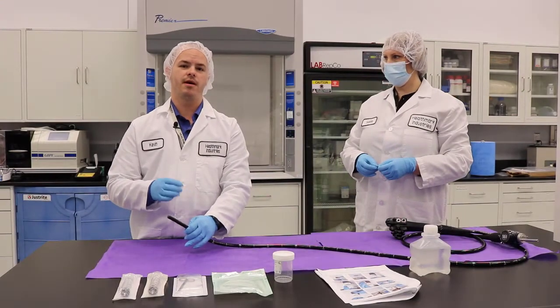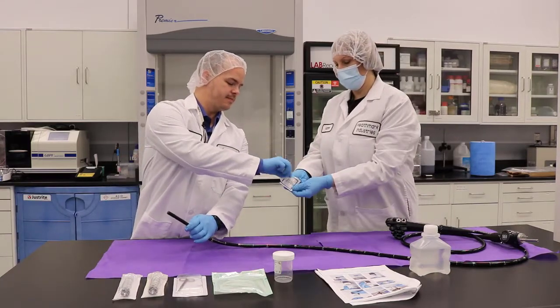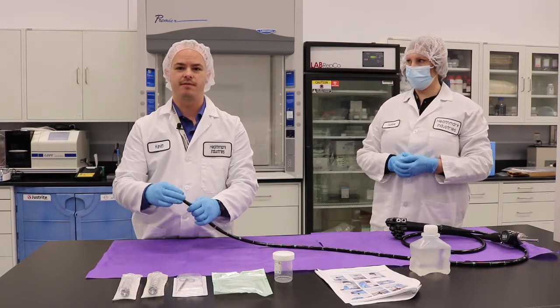My facilitator is going to open an alcohol wipe for me and I'm going to take it out aseptically. We're going to use this to wipe off and disinfect the distal tip of the endoscope.